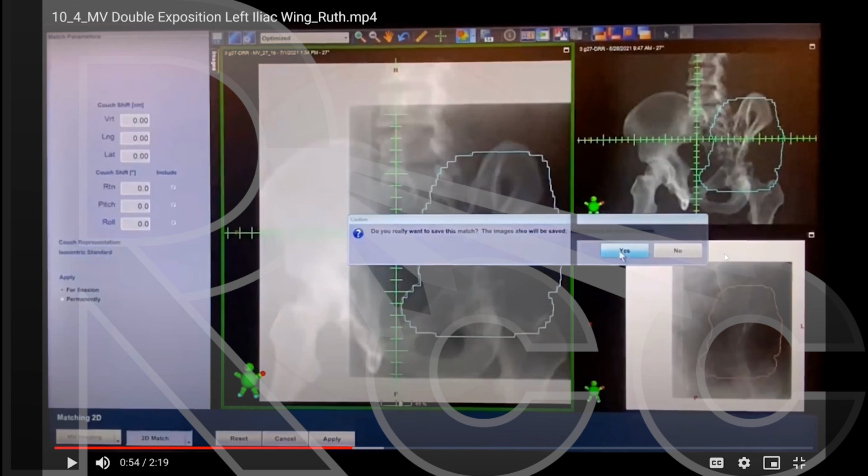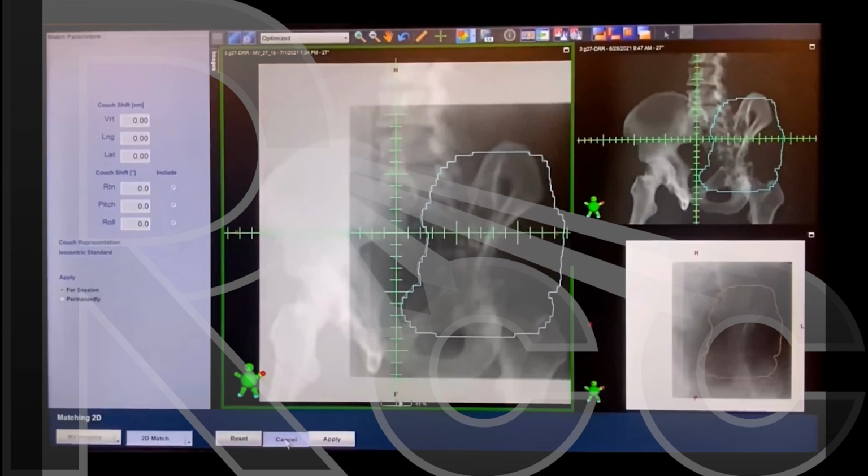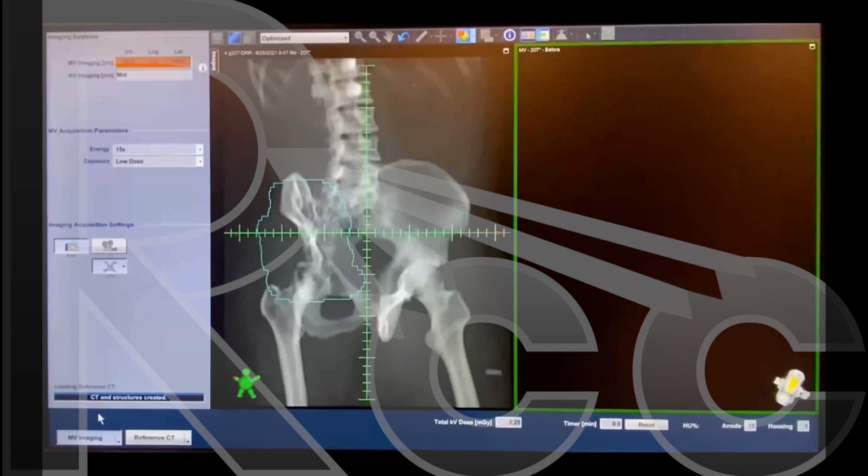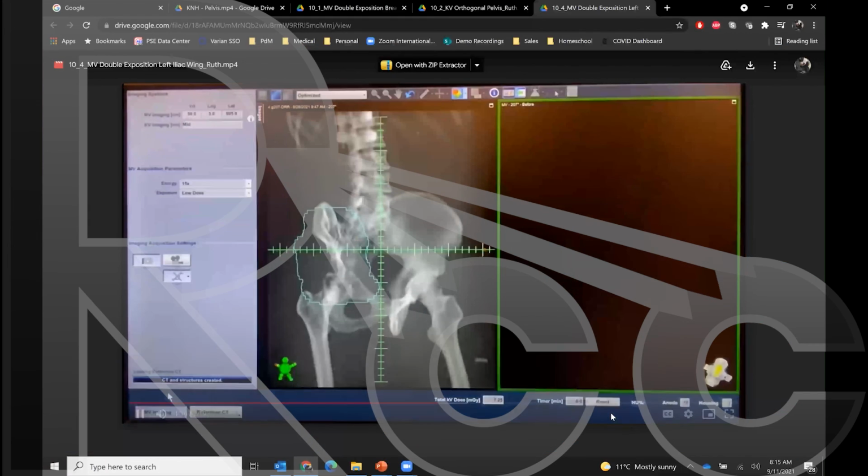And typically, at least in Canada, this is what we see a lot of our physicians reviewing. Our physicians want to look at a treatment field. They don't necessarily need to look at our KV imaging. They look at ConeBeam CT imaging in a lot of cases just to make sure, but this is really the nuts and bolts of what they're reviewing, signing off on, and what goes into the patient chart for record keeping purposes. It's also what we would potentially send off to another facility that is going to be treating our patient in the future, and just a great tool to identify where the treatment field is on the patient.